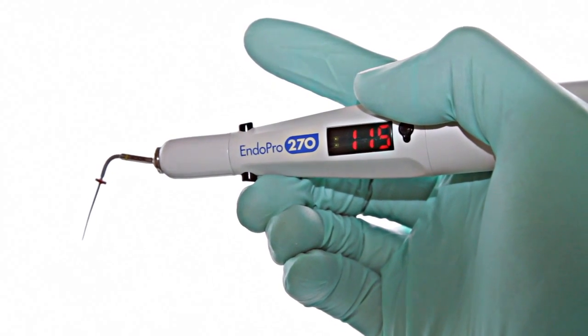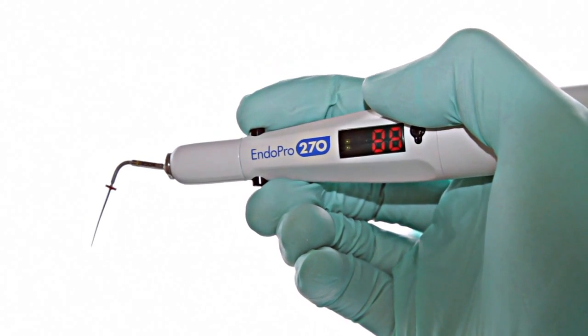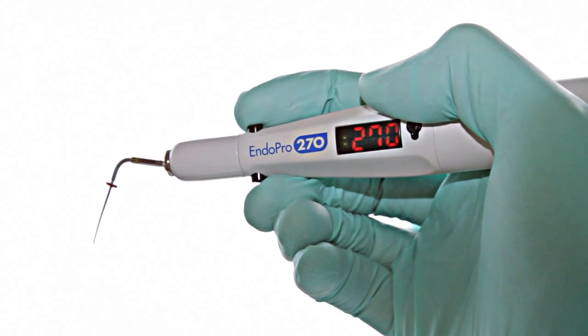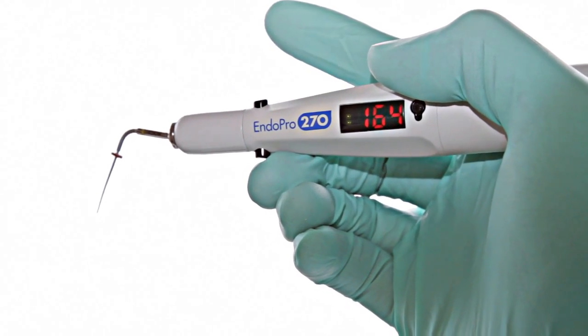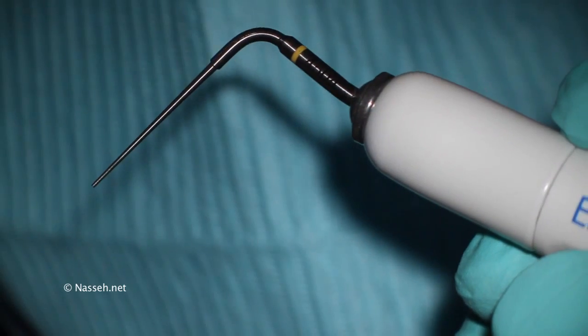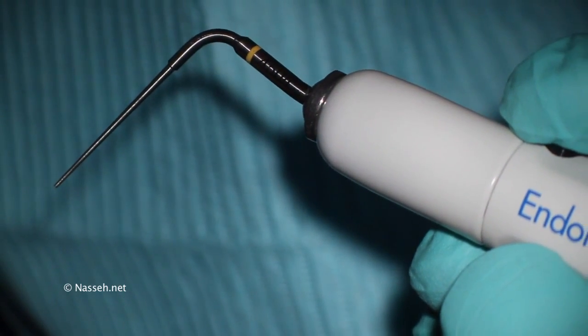About six different settings are possible for this unit, but for the most part the highest temperature setting, which is 270 degrees, is the one you can leave it on. The tip is a 45 tip with a 0-4 taper.